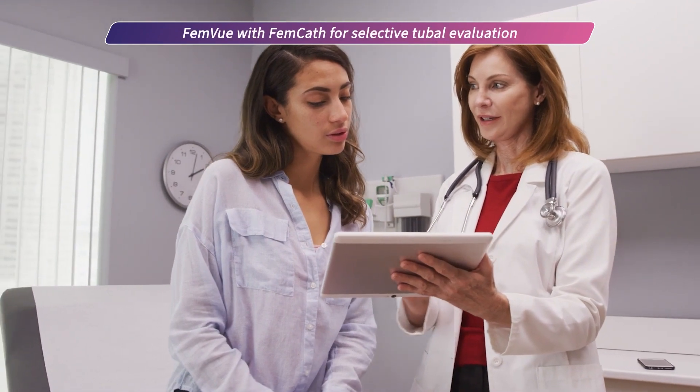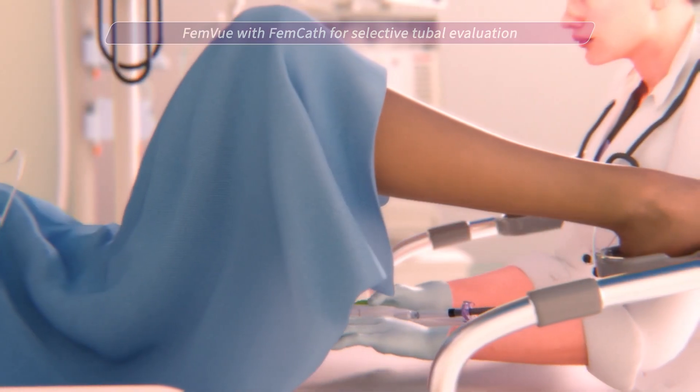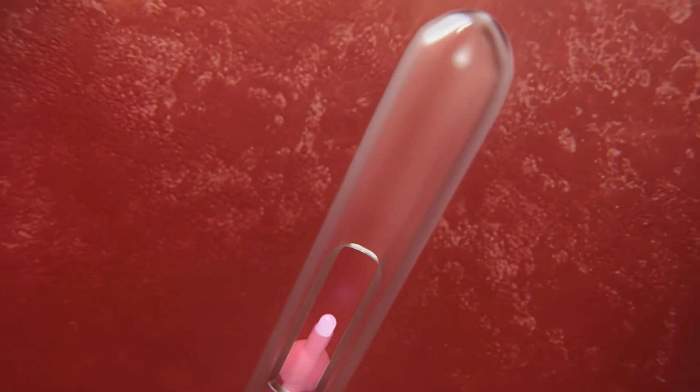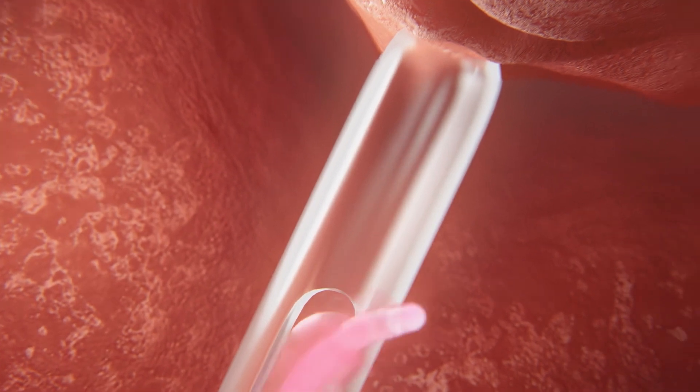FemVue with FemCath for selective tubal evaluation. FemCath is inserted into the uterine cavity. The balloon catheter is inflated at the opening of the selected fallopian tube.